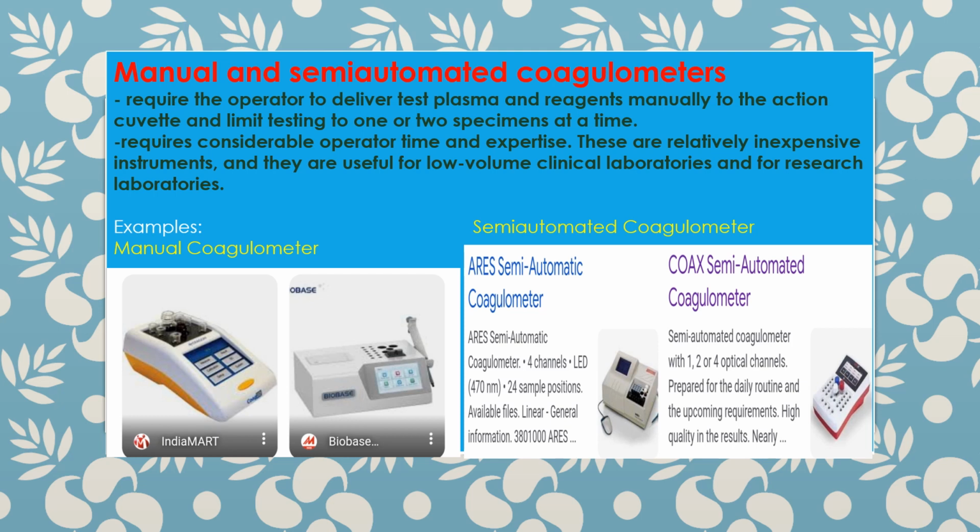So in this drawing, I have these manual coagulometers from the IndiaMart factory and BioBase factory, as well as the semi-automated coagulometers, the Ares semi-automatic coagulometer, and Coax semi-automated coagulometers.